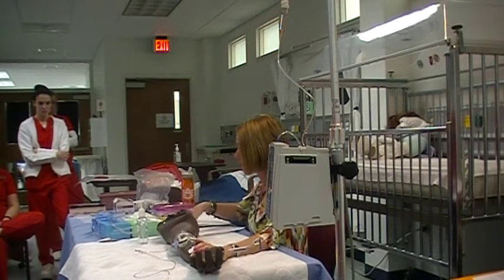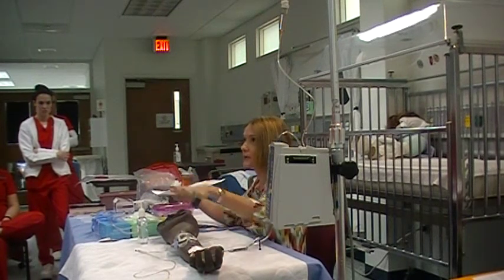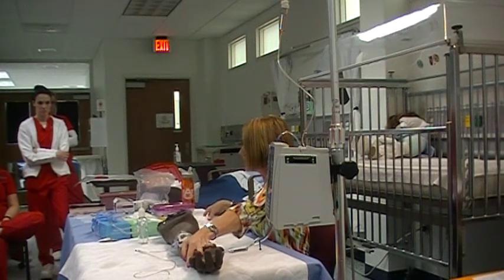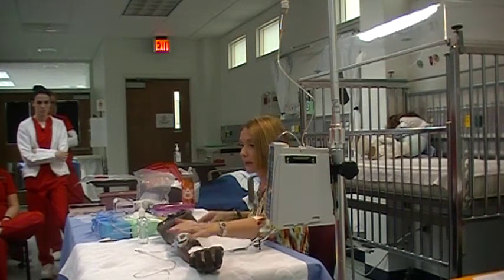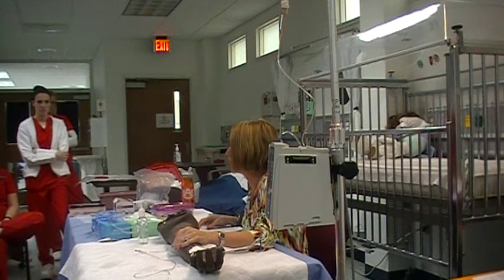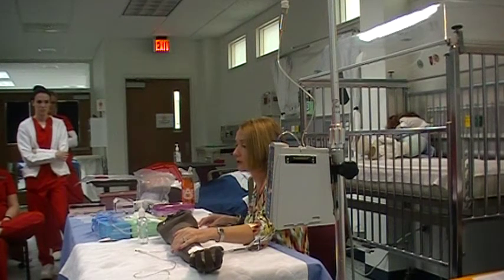We're going to confirm that the order that we have is truly the patient that we have, and we're going to confirm the allergies again. And then that's when we can verify patency of the IV. If you have an existing line, remember, just because it's going at 20 does not mean that that IV is patent. You need to go ahead and flush, okay, and make sure.